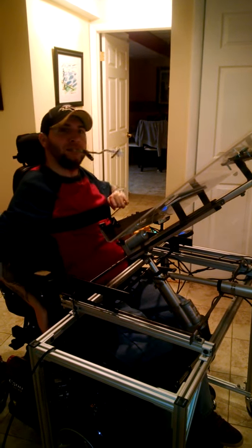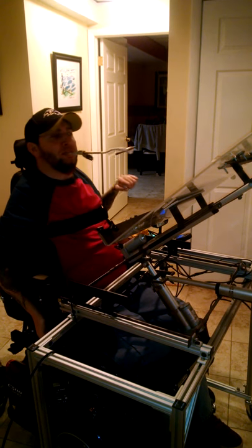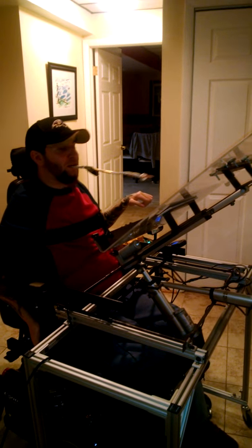Can't go too far because it will pop off down there. I'm going to have to fix that part. It's been a work in progress.